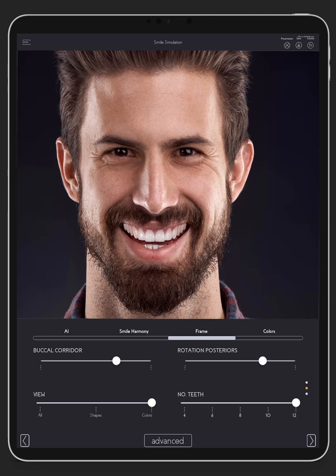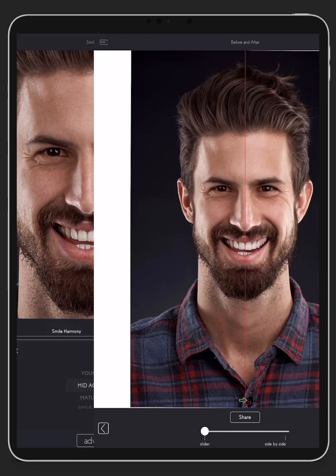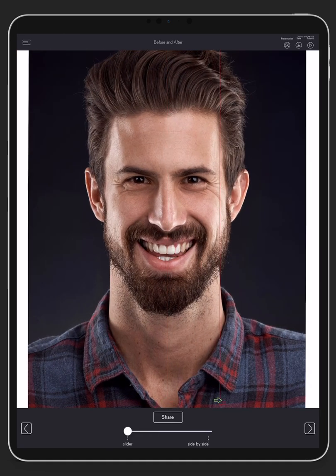It's a visual communication. We explain and show the patient what is the advantage of an aesthetic treatment, and we find out what is the patient's preference or expectation. Do you like the square shapes? Do you like triangular shapes? Do you like the edgy smiles?